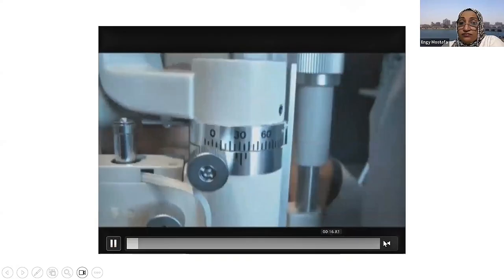You can do the direct and the indirect in the same maneuver, okay? And then you can do the retroillumination. Finally, you get to the specular and the sclerotic, which don't take so much time actually. But you can get out with this.